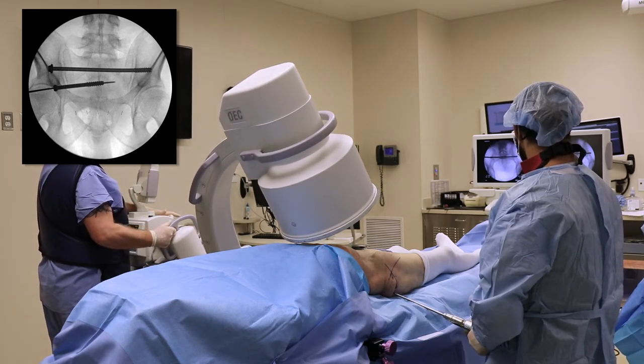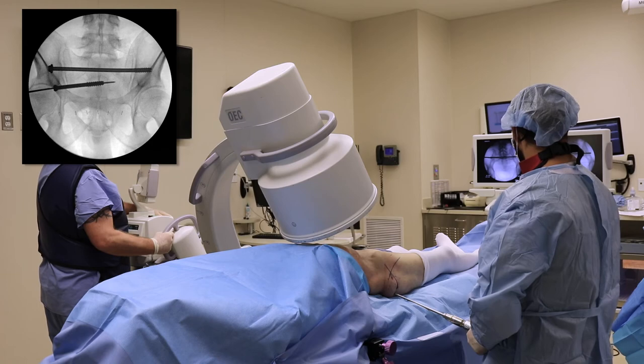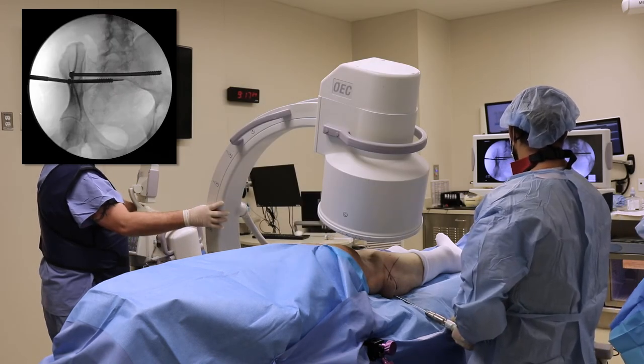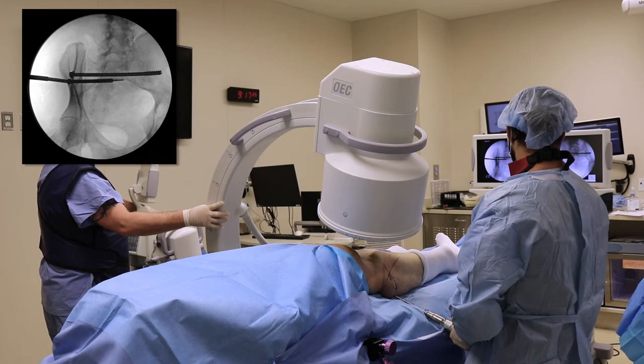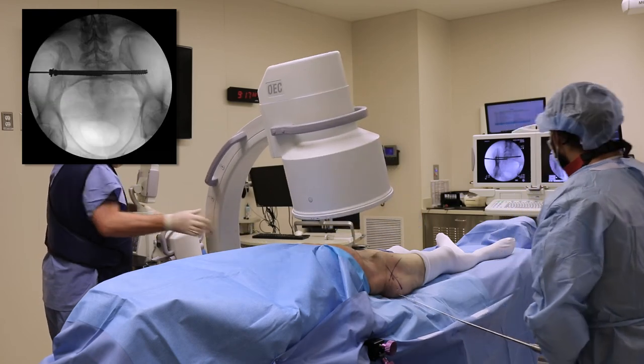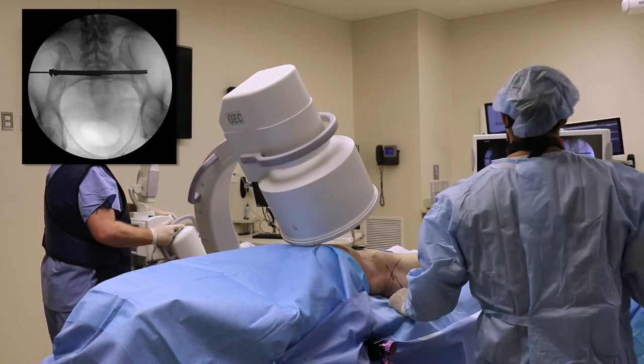The C-arm is rolled back over to check the position on the down-the-wing view. You can see that the screw head is seated up against the lateral cortex of the iliac wing. The C-arm is then rolled over to an inlet, where you can see the position of the threads in the S2 body.